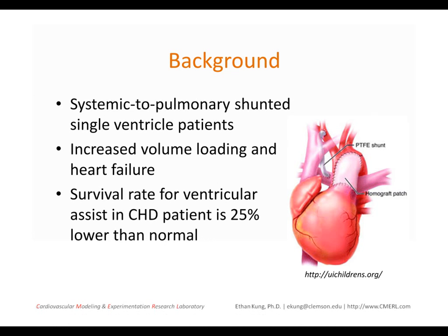In this study, we investigate the use of ventricular assist devices, or VADs, in single ventricle patients who have had the stage 1 Norwood surgery. In this type of circulation, the pulmonary and systemic blood flow are in parallel. The increased volume loading on the heart corresponds to an increased risk of heart failure.